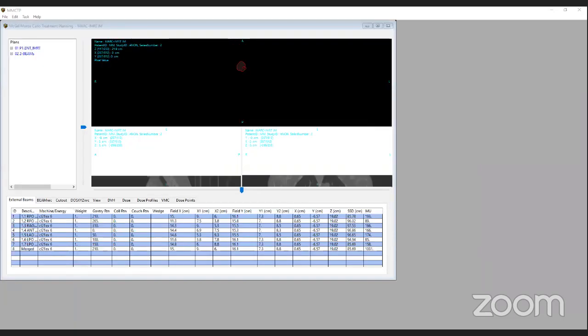So it's an effort to model the backscatter into the monitor unit chamber. What I've found is, I haven't used it because I haven't actually validated to see if it's correct for my simulations.